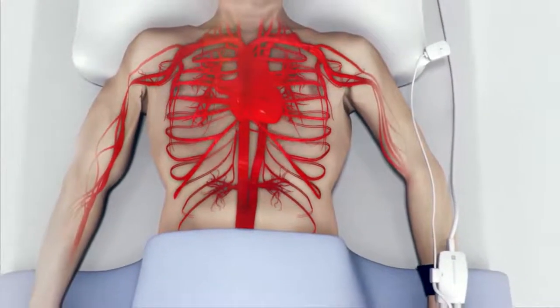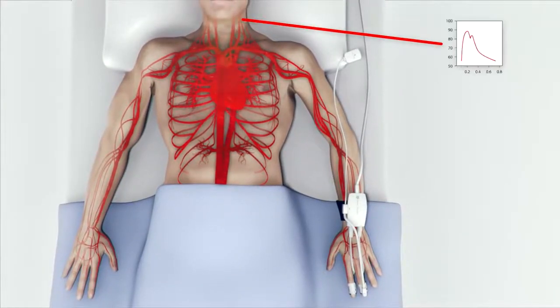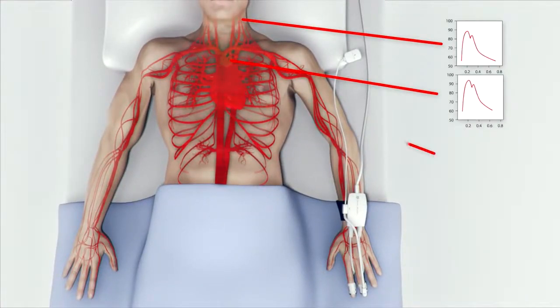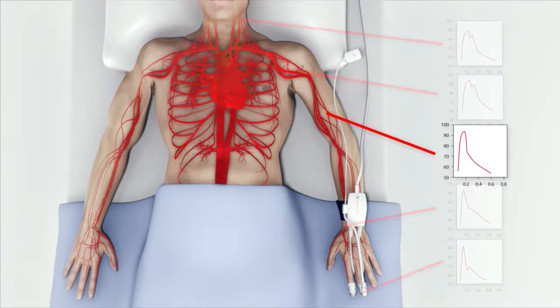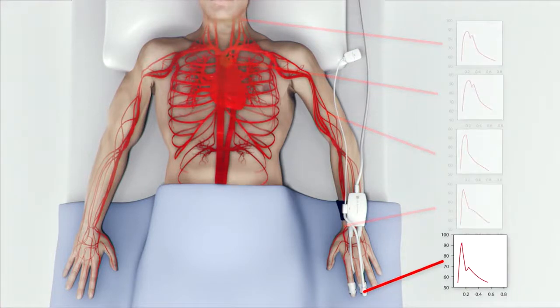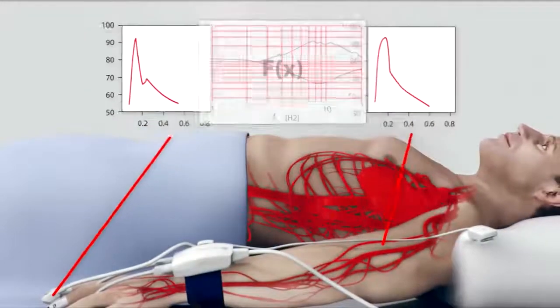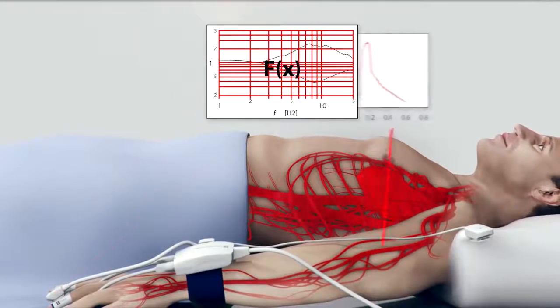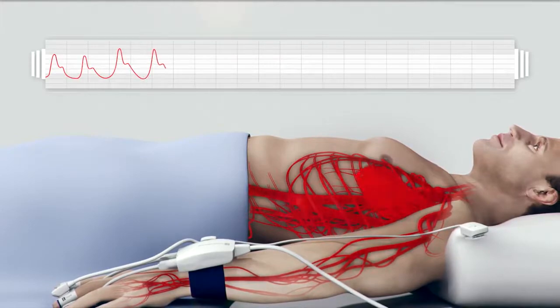Since the arteries narrow as the distance from the heart increases, increased resistance and backwards reflection of the pressure waves occurs, resulting in varying pressure levels and waveform shapes. The brachial site has long been the clinical standard for non-invasive blood pressure measurements. The finger site, however, has slightly lower mean pressure levels and usually an increasingly peaked waveform toward the periphery. Therefore, the finger pressure waveform must be transformed to be comparable to a brachial site waveform. The ClearSight system does so using a mathematical transfer function based on a vast clinical database.